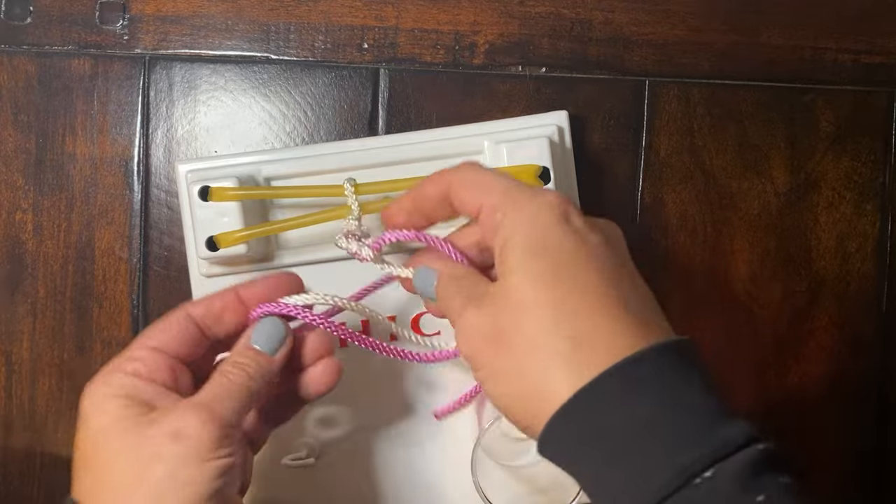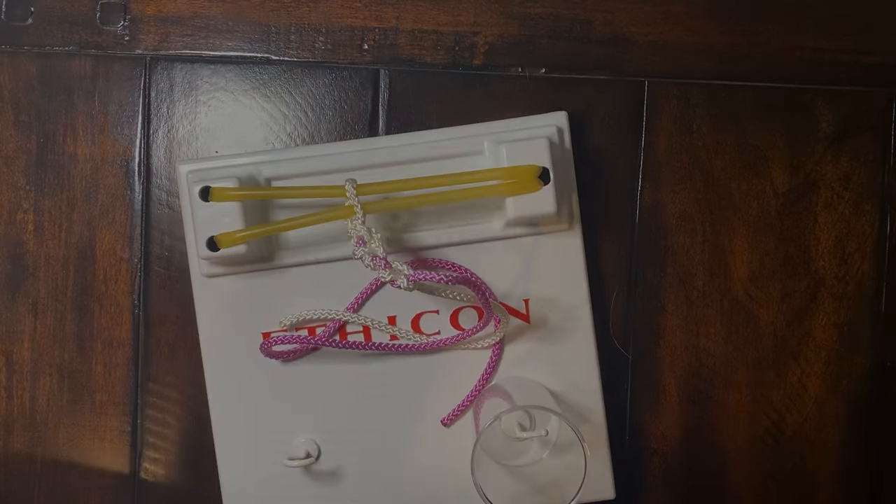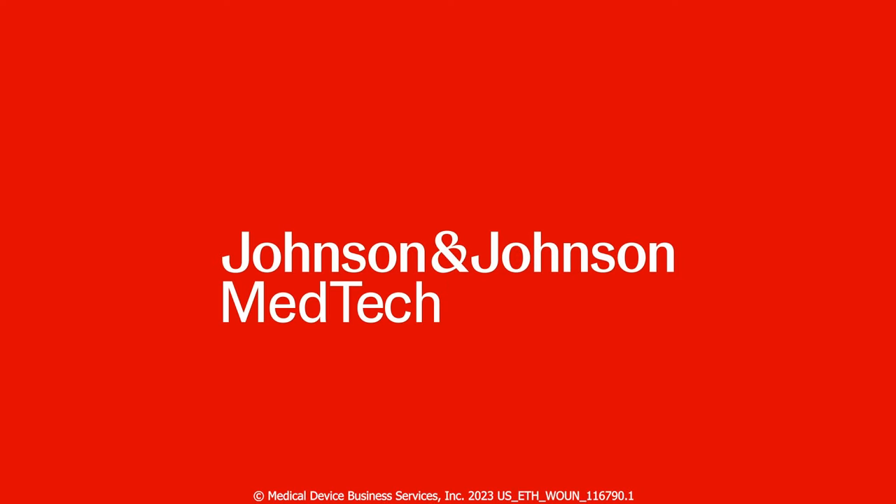This will be good practice for two-handed knot tying technique — move forward.